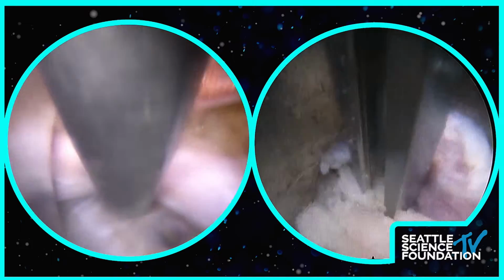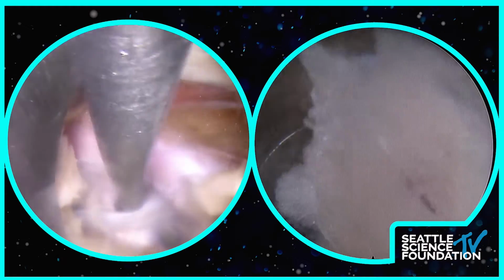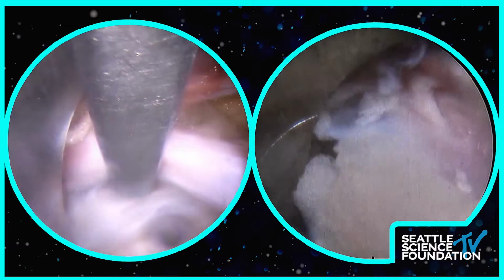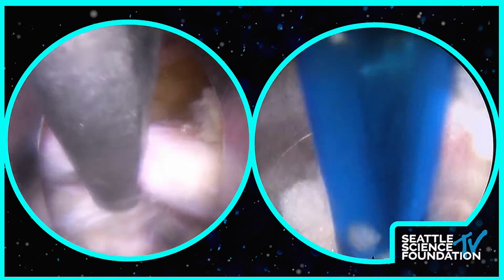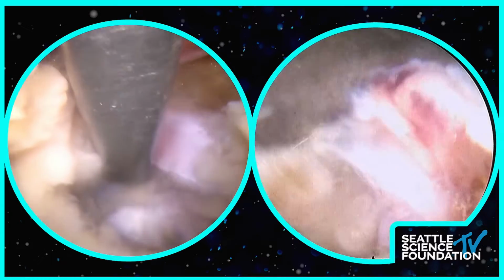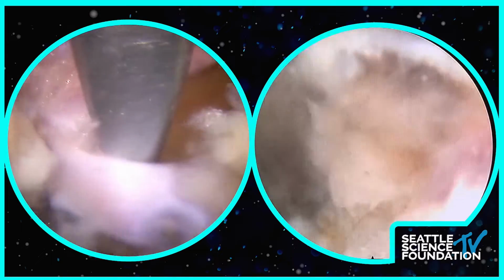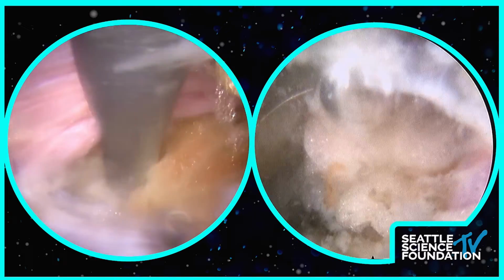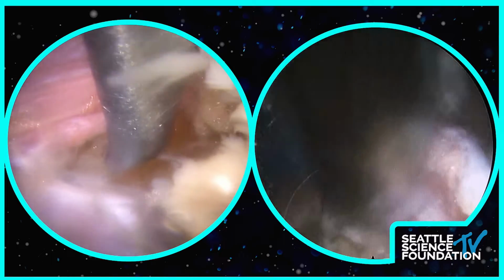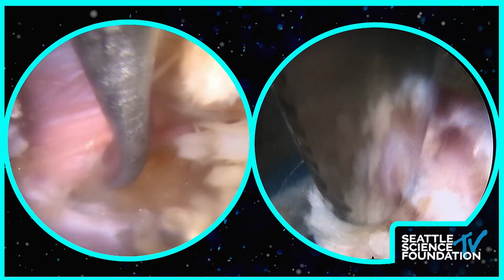Kind of the bipolar, please. This is a lot like the view that you get from traditional open or tubular surgery, so the anatomy will be a lot more familiar. What I typically do, after I get this exposed, is I want to see that shoulder. You don't want to take a disc out between the thecal sac and the nerve root. Sometimes a disc herniation is very large. In those cases I'll sometimes grab it out of here, but you can get a dural tear if you go between the thecal sac and the nerve root.